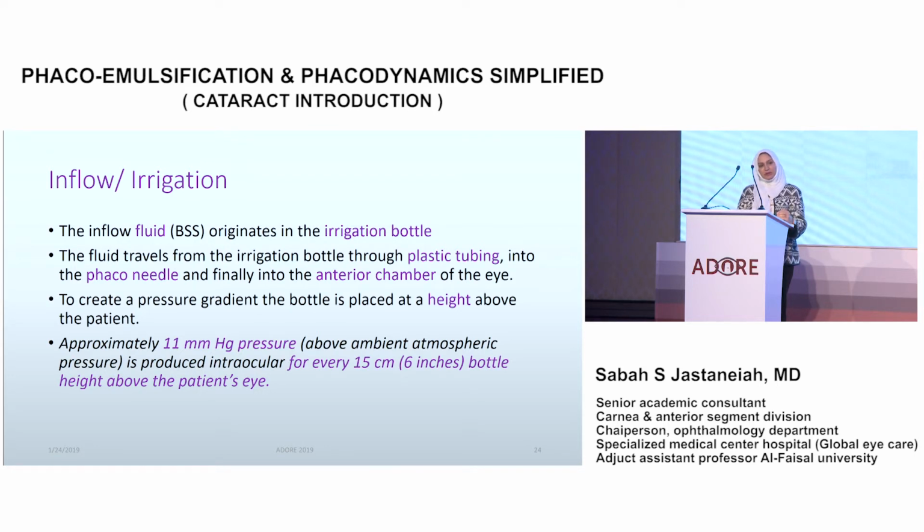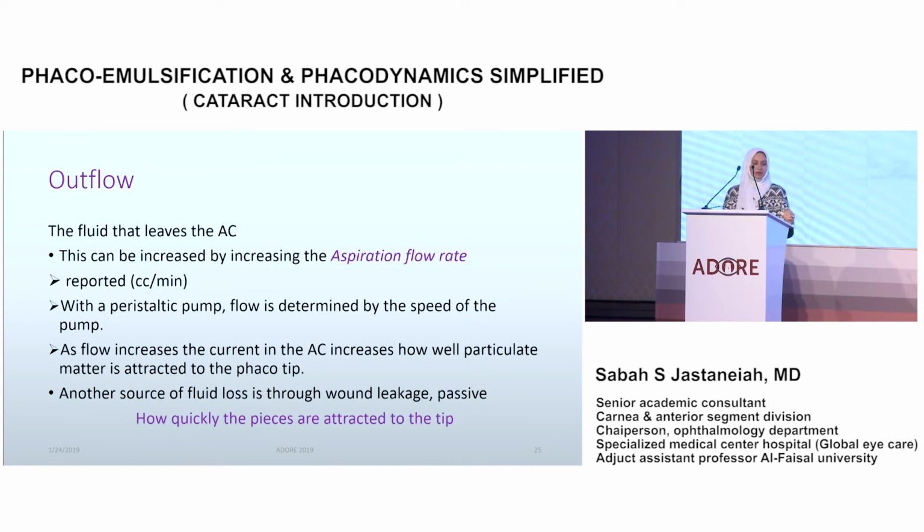For example, in myopic patients, I slightly lower the bottle because it creates a lot of pressure on those highly myopic eyes and a lot of pain. So you have to remember that you have a bottle whose height you can adjust in order to help in your surgery.